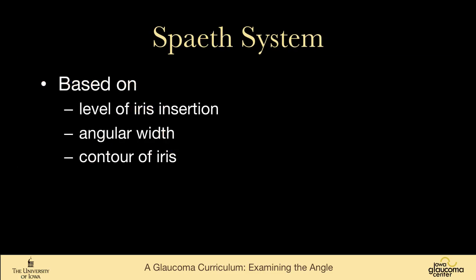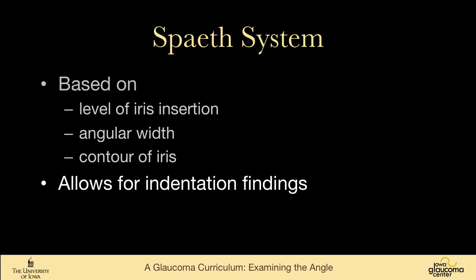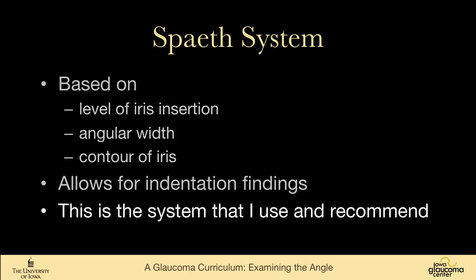The Spaeth system is based on 3 things: the level of iris insertion, the angular width, which is the same as the Shaffer system, and then the contour of the iris. This system allows for indentation findings, which is very helpful, and is a system that I use and teach and recommend.